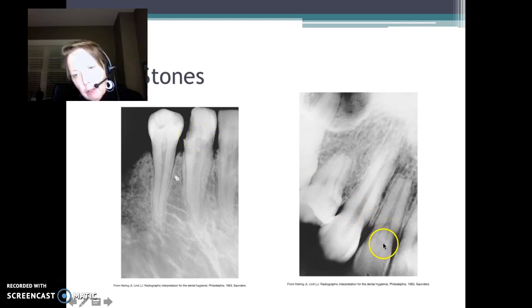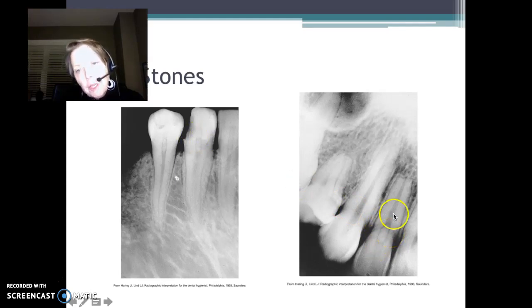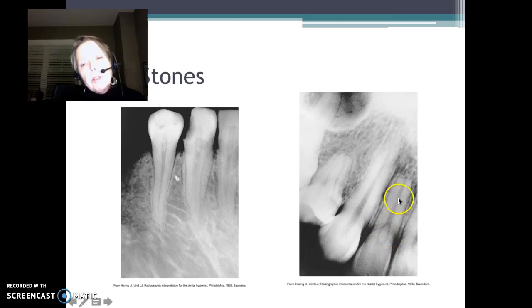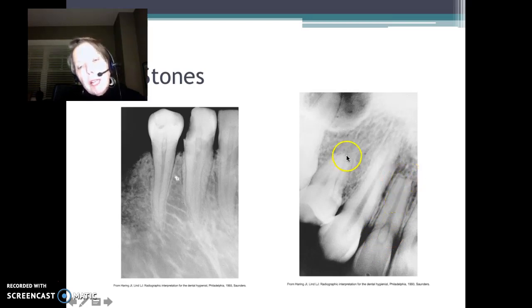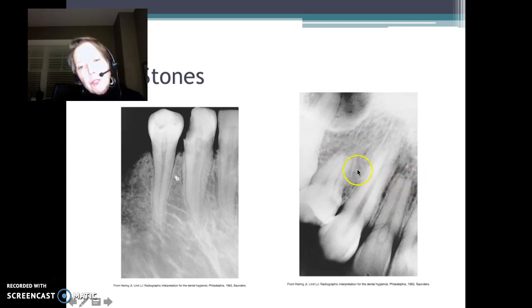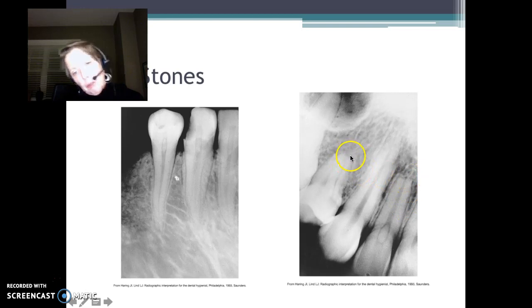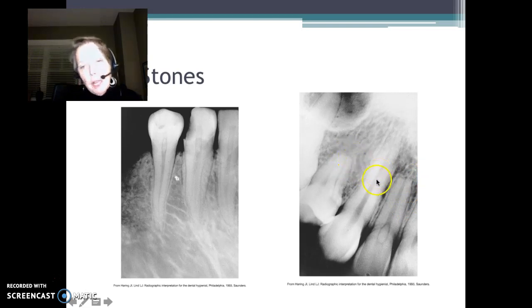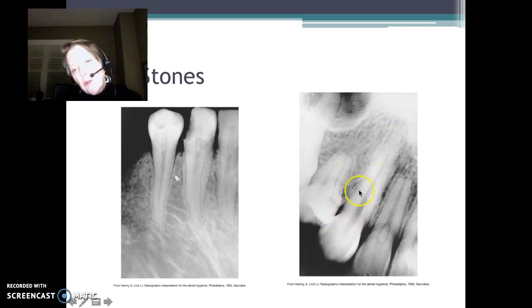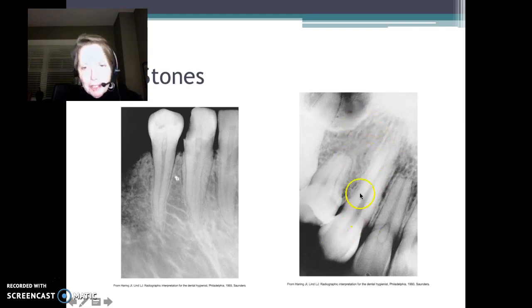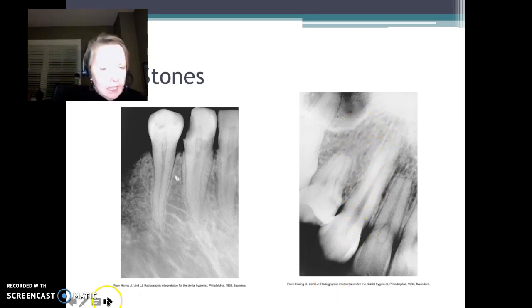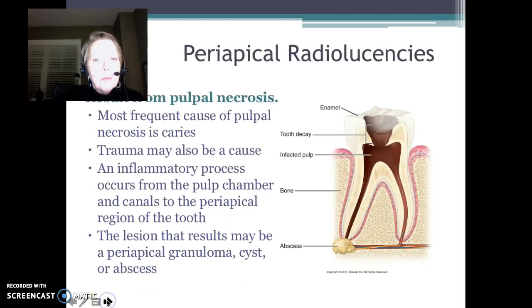Take a look at tooth 7 — also a pulp stone. We're seeing some other things here as well: external resorption on the roots. External resorption on tooth 7, external resorption on tooth 5. Also not an ideal image — we want that canine centered in the PA and standing up and down.